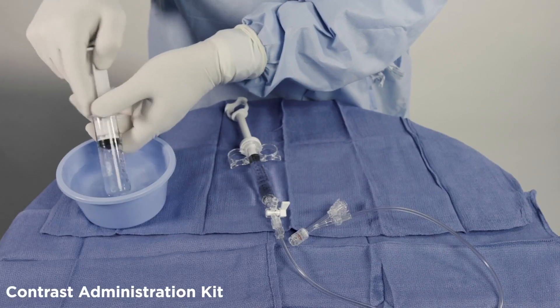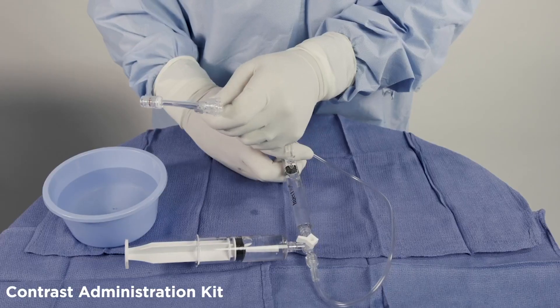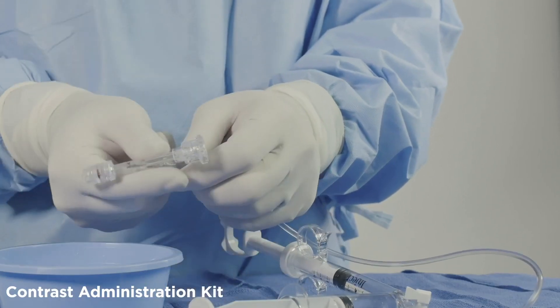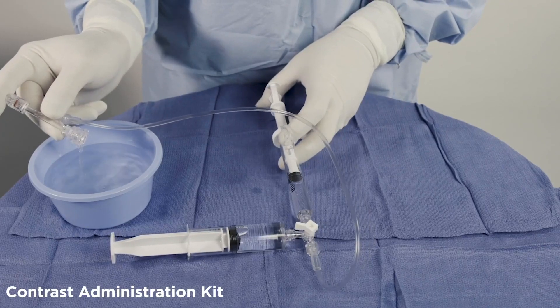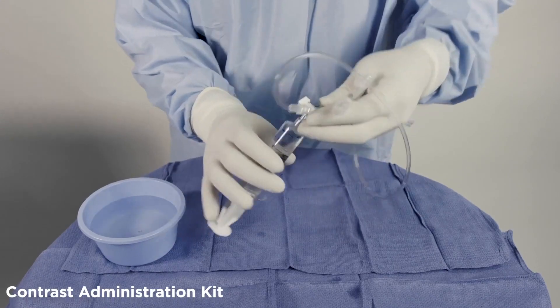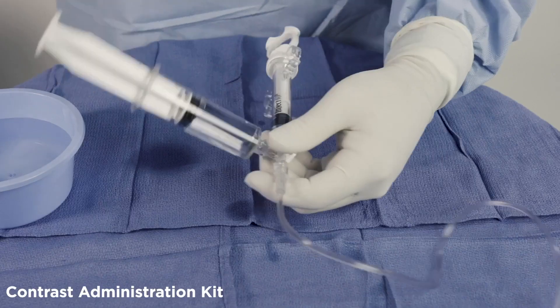Then fill the reservoir syringe with saline and attach it to the remaining open port of the three-way stopcock. At this point, remove all air bubbles from the system. After purging the system of all air, turn off the stopcock to the reservoir syringe, remove the syringe, replace fluid with contrast media, and reattach to the administration kit.